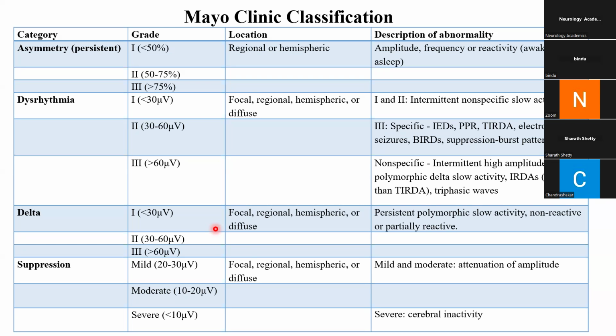And more than all this, there are benign variants which are not included in this, so we have to qualify it separately. I was telling Neena also, when we looked into the benign variants in our laboratory, we always have to give the search words as BSSS and this and that. If it had been included in this classification, the number of cases that would have been missed would have been very less. For example, you may be seeing a BSSS and reporting it, but another person thinks that it's a benign variant. Why should I report it? So there are certain fallacies regarding that.